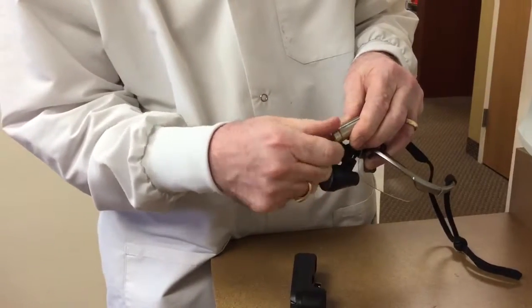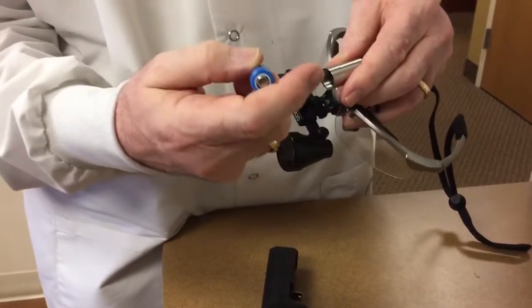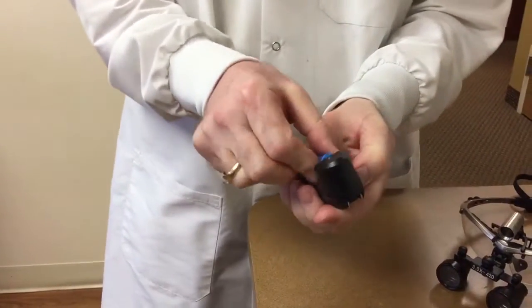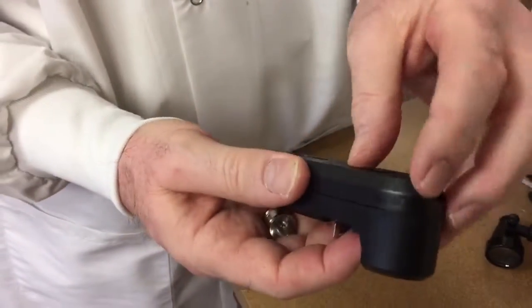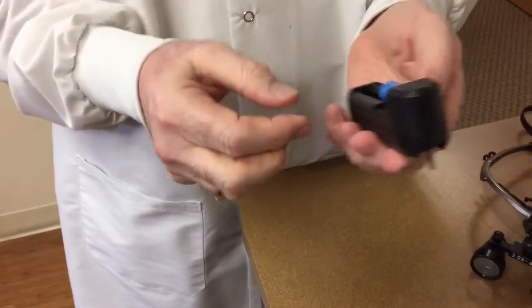You unscrew this totally. Remember, when you take the battery out, the plus side always goes towards the front. When you put it in the charger, same thing — the plus side always goes towards the front. Then all you need to do is plug this into your outlet and you're ready to go.